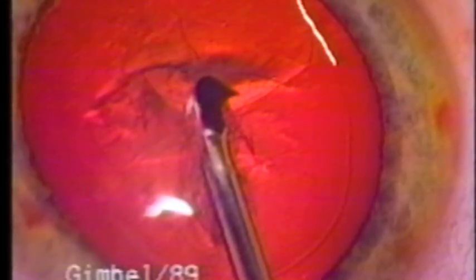So we pause at this point, add air, and then a viscoelastic. You'll notice we're putting air in before releasing the irrigation fluid with the cystitome.